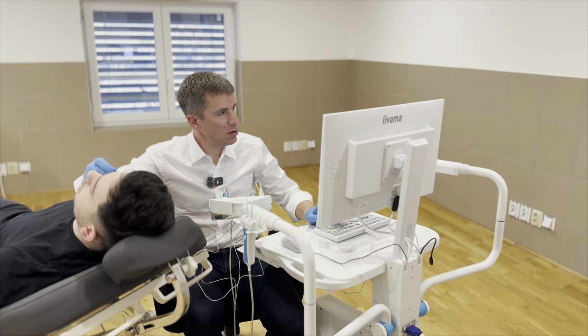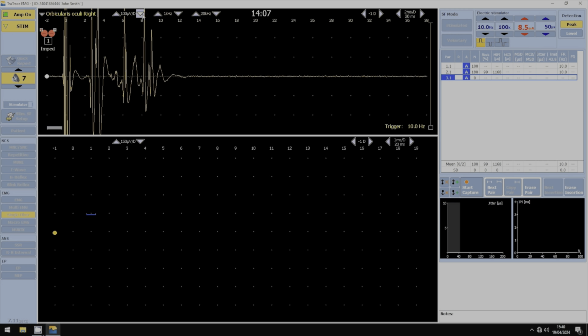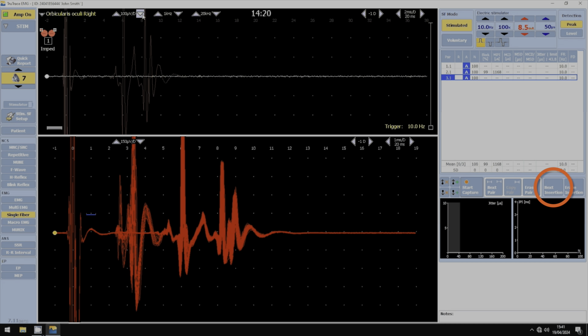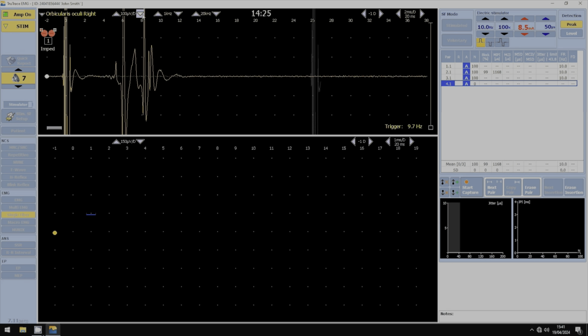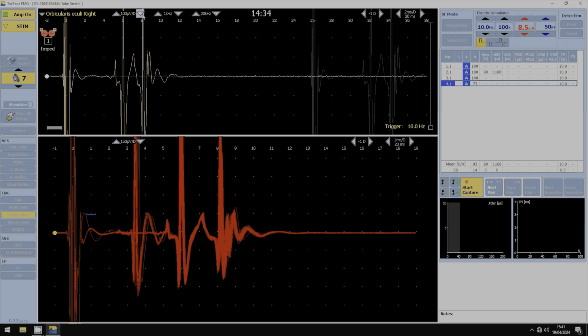I turn the needle 90 degrees to find other pairs. So it's not only turning the angle of the needle, it's also about turning the needle itself around its axis. Very beautiful pairs here. I will go to the next insertion, start the stimulation, and start the recording. 100 recordings.